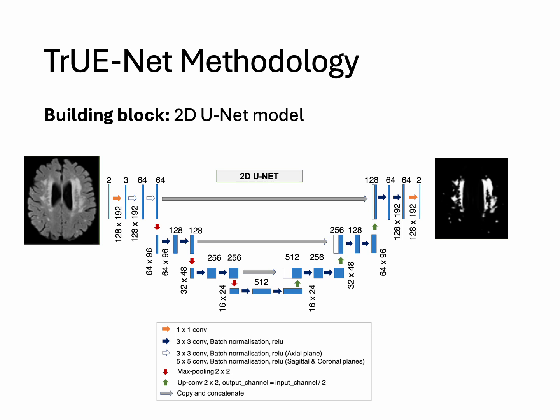So at the decoder end, the U-Net combines both the texture information and the location information to give a very accurate segmentation output, or voxel wise classification output, to give the final probability map. Here we show the thresholded version of the probability maps, but we do get a very reliable probability map, especially along the boundaries, because the model is able to encode both the texture and the location based information.